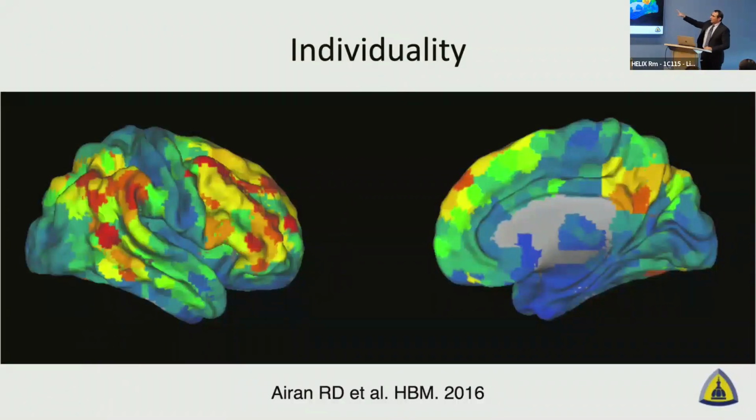And so when you map out the part of the brain that determined how unique individuals are, like which part of the brain had the most effect on pairing the scans together, you end up with this map, which was really nice to see because it makes sense that the blue areas had not much to do with pairing scans together. Those blue areas represent motor systems, visual system, more primitive systems that are really not that different across individuals.